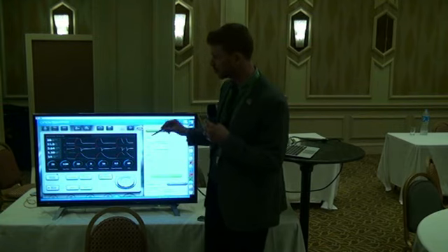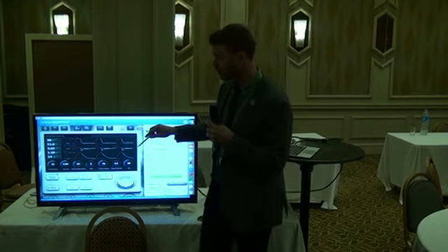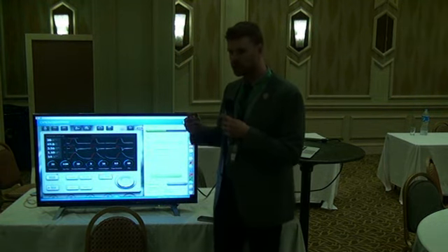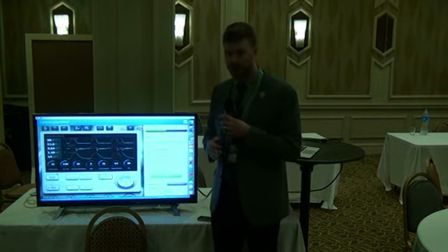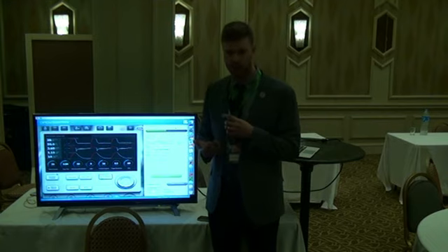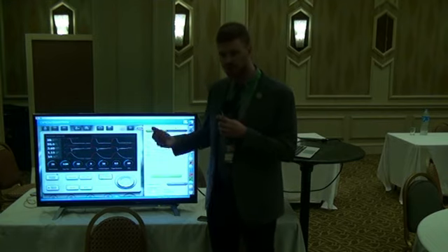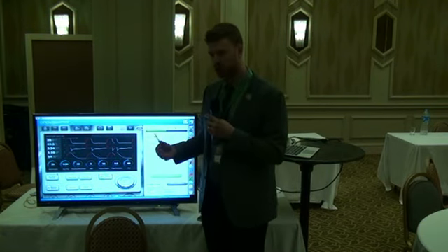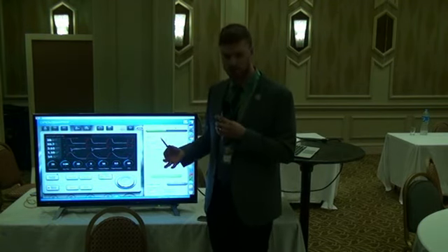I think in general, the way I think about waveforms, also capnography, is that it's always telling you something, but it's not telling you everything. And so you always have to look at different pieces of the clinical interpretation of that case to convince yourself what the problem is. So we're going to auscultate, and it's going to sound really junky. It'll probably sound like we need to suction that patient.